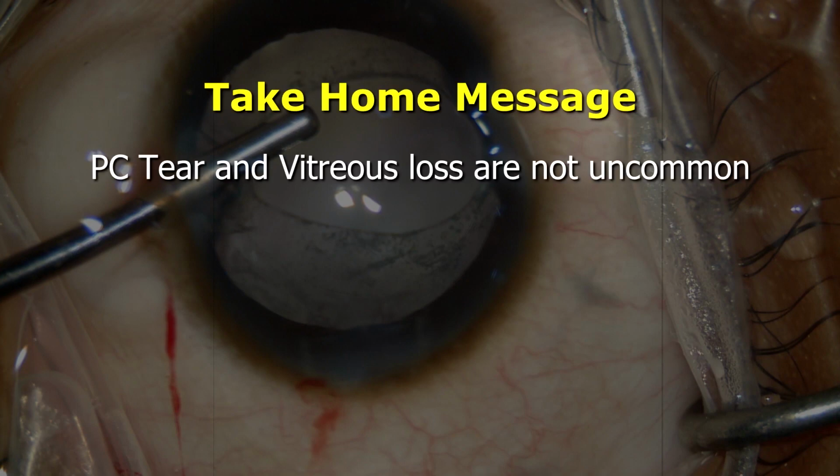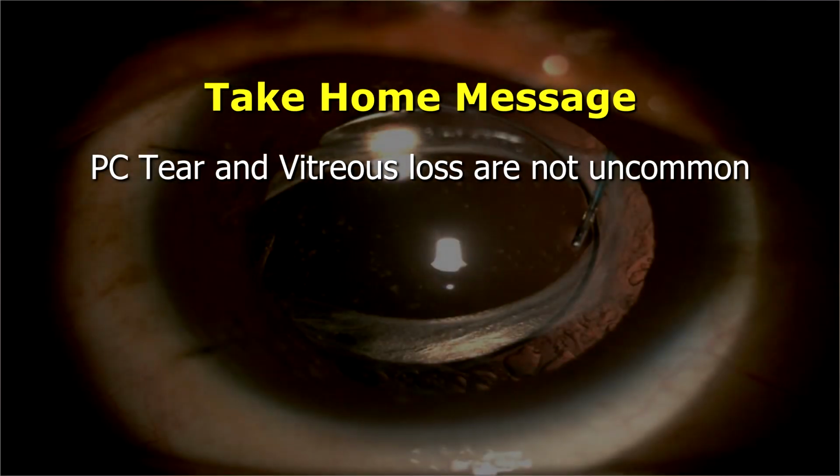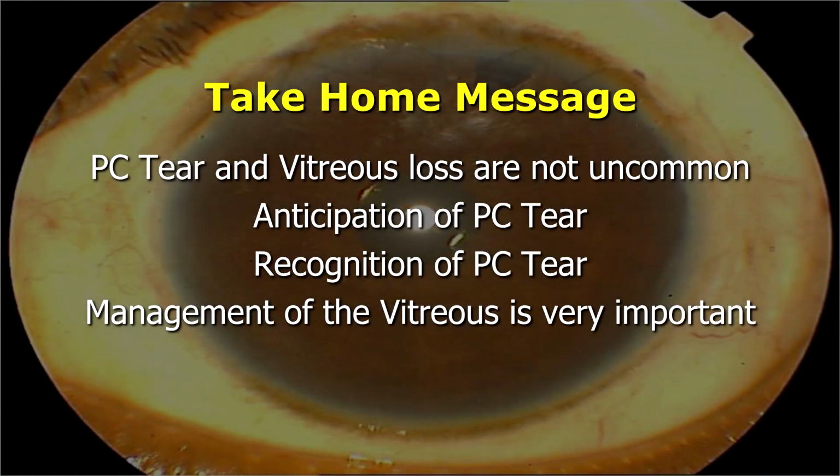PC tear and vitreous loss are not uncommon. They can occur even to experienced surgeons. Anticipation of the PC tear, recognition of the PC tear, and management of vitreous is very important for successful outcome.